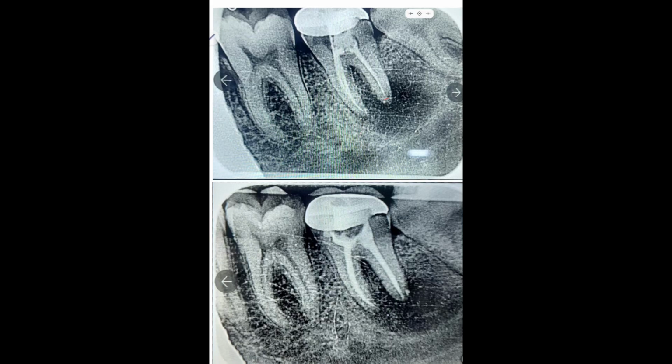But the problem was with the seal at the apical part, or the seal in the canal, because the minute we placed the H file into the GP and pulled it out, the whole GP, especially in the distal canal, came out in one stroke. It did not take more than 2 minutes to retrieve that GP. That was how poor the seal was in the previous treatment. So this again proves that when you don't properly seal the apex, you will see the patient back again with pain. So when there is no proper apical seal, there is no proper treatment that has been done.